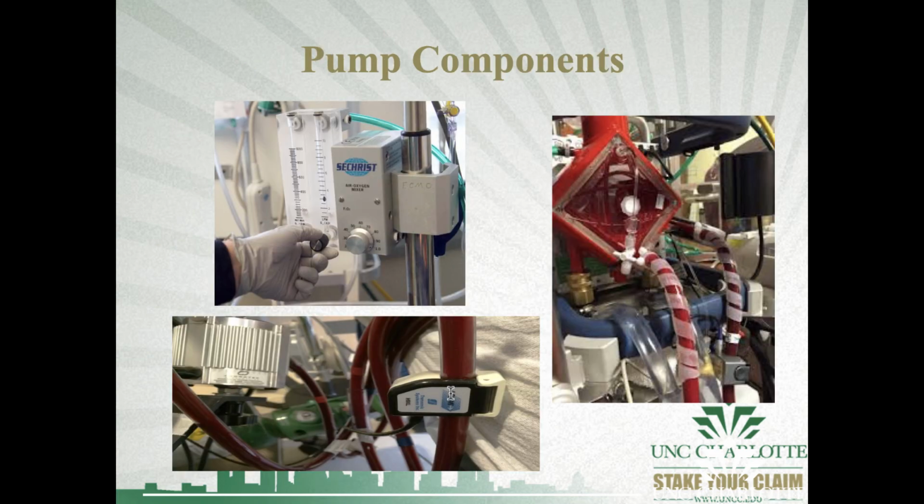Here are some examples of pump components. Now, a lot of these examples are from a machine that's called a CardioHelp. There's other machines that I've worked with called the Rotoflow. There's a bunch of other things out there that you might see, the CentraMag, but generally you'll see the CardioHelp, and it's a pretty simple machine actually.